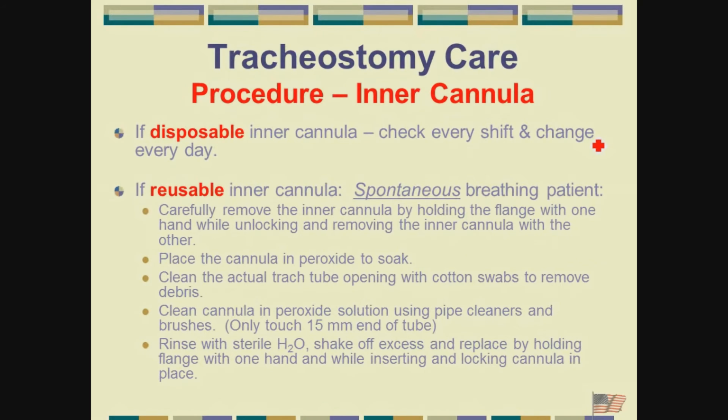Go ahead. But you do want to remember that it is a surgical wound. You want to hang on to that flange, especially on a fresh post-op trach, because it hurts. You just sliced open somebody's neck, and by turning that thing, you're turning that whole trach. So you just picture a cut, and you're twisting something, it hurts. So you want to hang on to that flange as you're twisting that trach off, so you're not constantly playing with that whole trach site, okay?